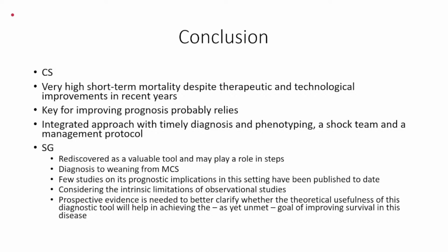And in all this scenario, the Swan-Ganz is being rediscovered as a valuable tool, and it may play a very important role to diagnose the cardiogenic shock, to classify it, to help us decide which therapy to use and when to wean from that therapy.